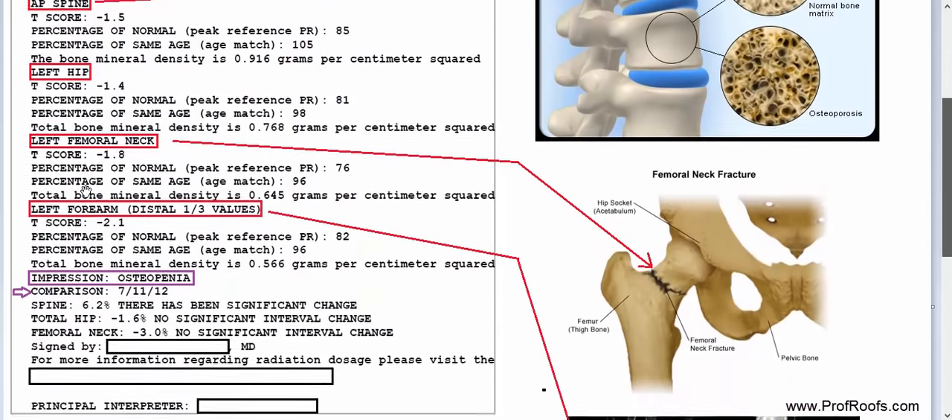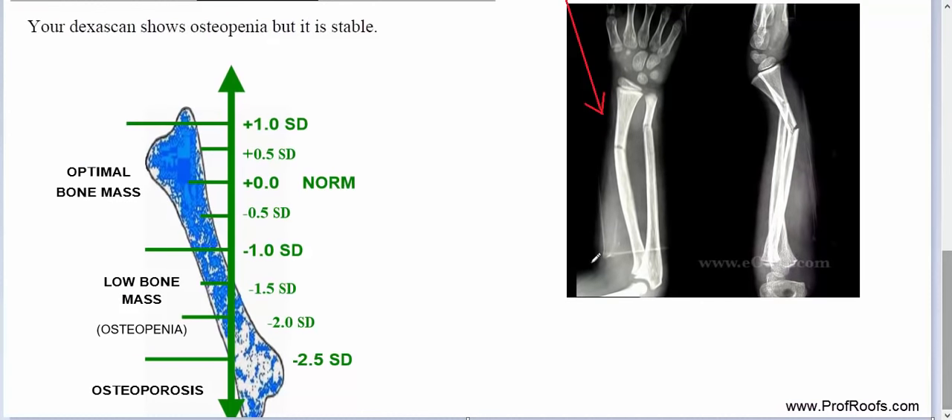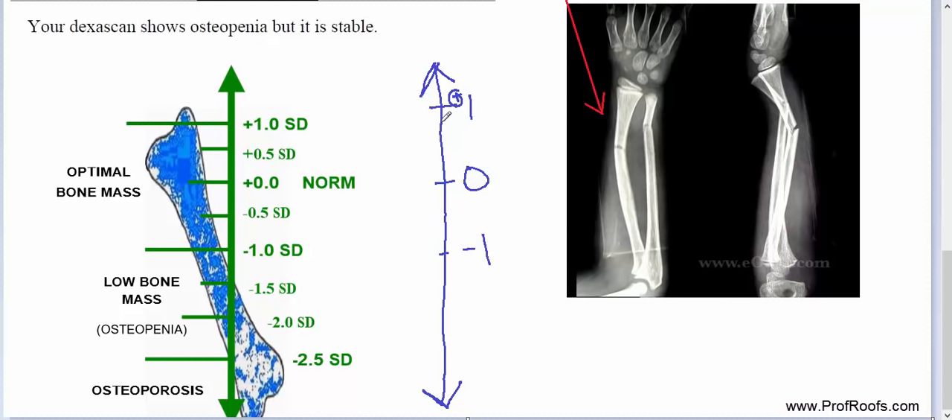Before we go over this report, go to the bottom and see the different scale. If we make a scale here, we start at positive 1, then 0, and then negative 1. This area from positive 1 down to negative 1 is normal — normal bone density. And then when we go from negative 1 all the way down to negative 2.49, this area is called either low bone mass or osteopenia.